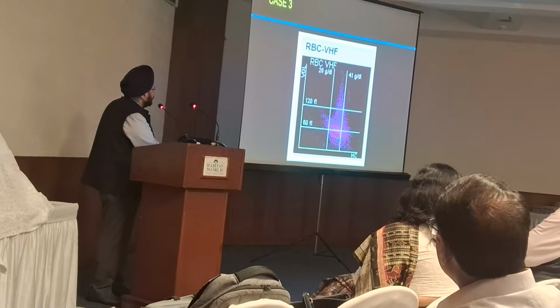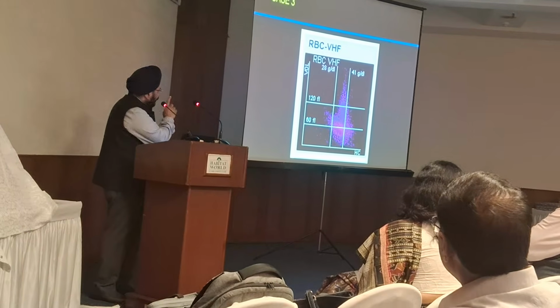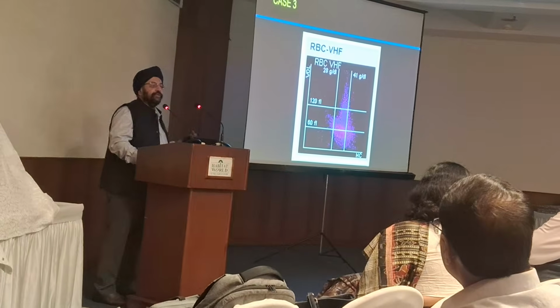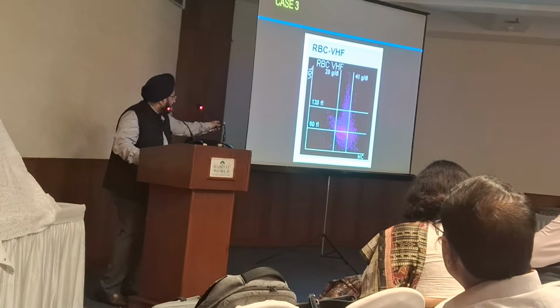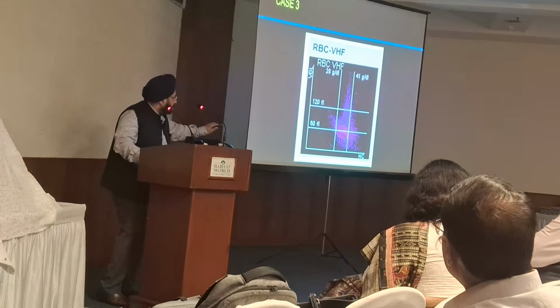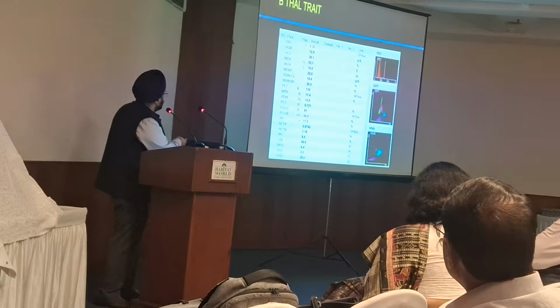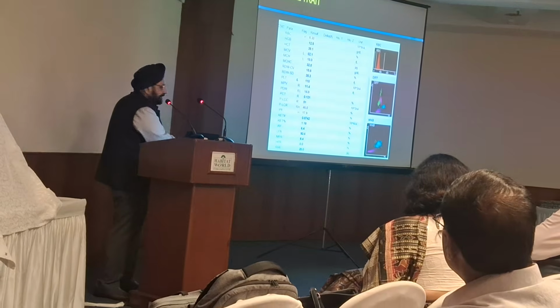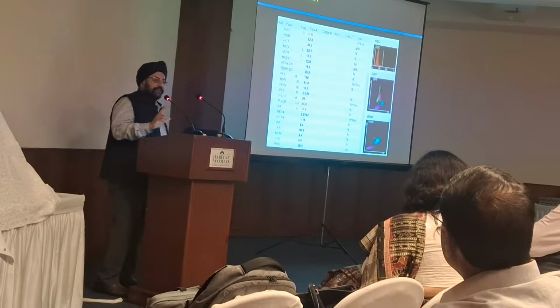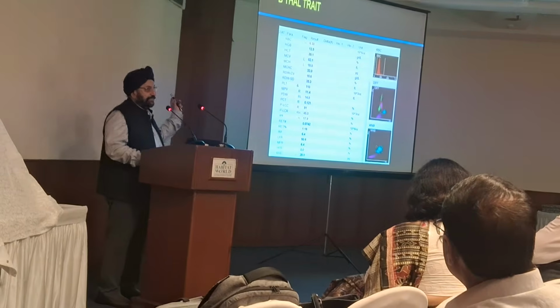Look at this graph in contrast to the previous one. There is only microcytosis. There is no hypochromia. So, beta thal trait will always have only microcytosis. There will be no hypochromia. This is a case of beta thal trait, just on the scatter plot, I have not seen the indices. Hemoglobin 12.5, you look at the Mentzer index, it's 10. RDW is normal, it is given away. The only problem will occur when there is both IDA and beta thal together. Then it will look like the previous graph of IDA.